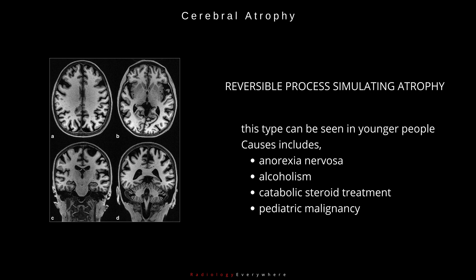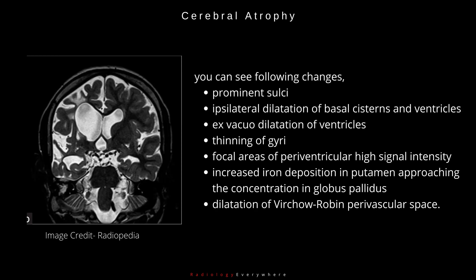C. Reversible process simulating atrophy. This type can be seen in younger people. Causes include anorexia nervosa, alcoholism, catabolic steroid treatment, and pediatric malignancy. You can see the following changes: prominent sulci, ipsilateral dilatation of basal cisterns and ventricles, ex-vacuo dilatation of ventricles, thinning of gyri, focal areas of periventricular high signal intensity, and increased iron deposition in the putamen approaching the concentration in the globus pallidus.